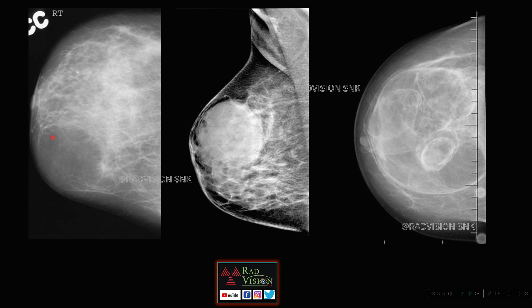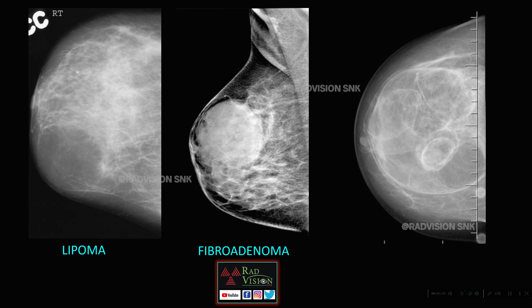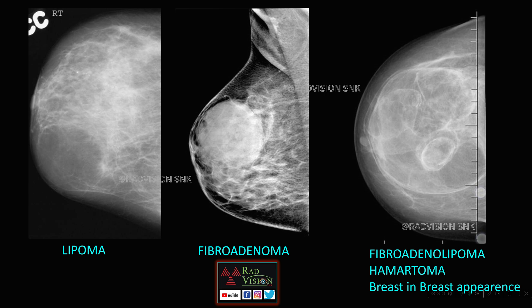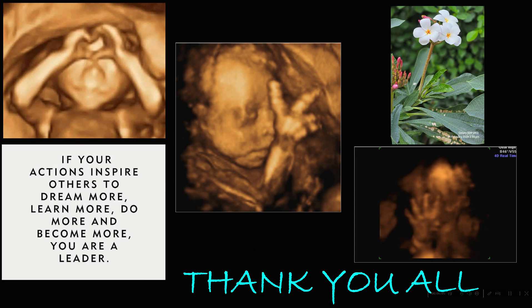The last case covers breast lesions. A hypodense lesion in the inferior quadrant of the breast with a thin wall is a breast lipoma. An iso- to hyperdense well-defined lesion with a capsule is a fibroadenoma. A lesion with both hyperdense and hypodense components, calcifications, and classical breast-in-breast appearance is a fibroadenolipoma or hamartoma. First case: lipoma; second: fibroadenoma; third: fibroadenolipoma or hamartoma — the breast-in-breast appearance. Thank you all.